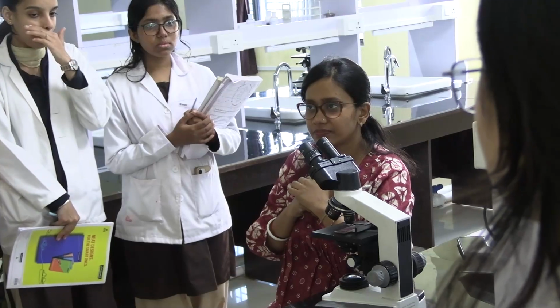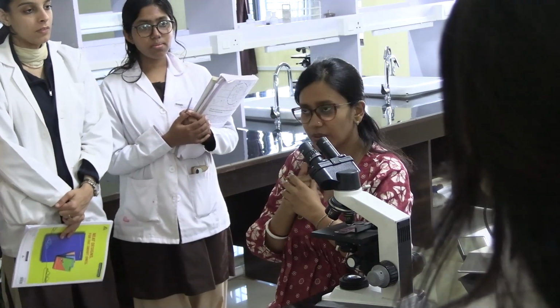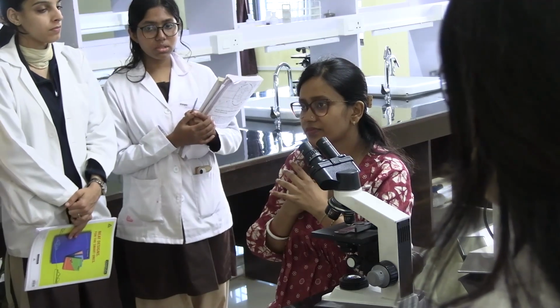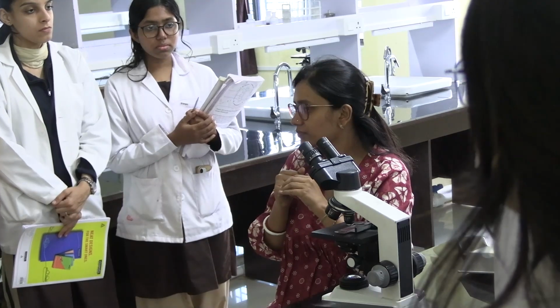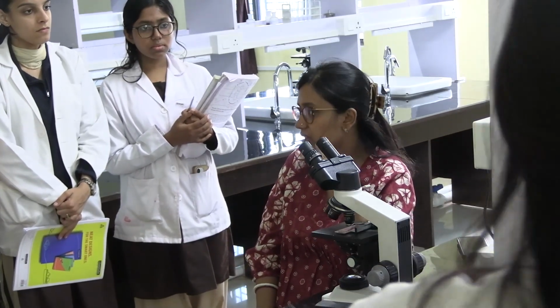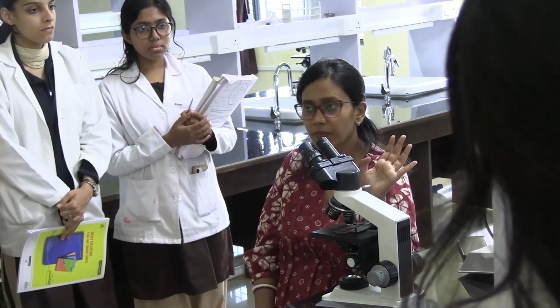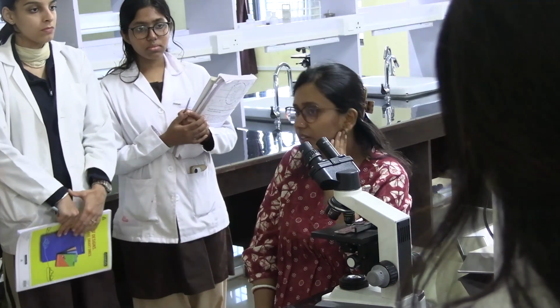Can you give me an example? Okay. Something in the bone? Yeah, okay. That is one example. So today, we'll see a few slides and specimens of neoplastic lesions. What I'll be showing you today is the slide for a malignant lesion. Now what we have chosen for today is adenocarcinoma.